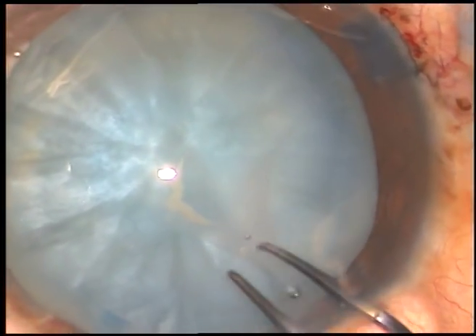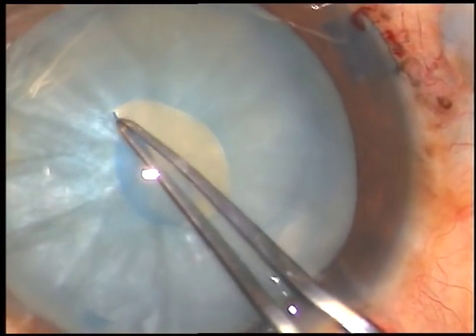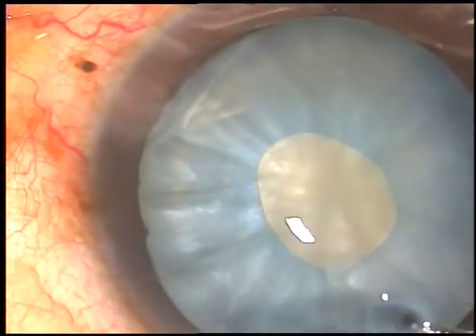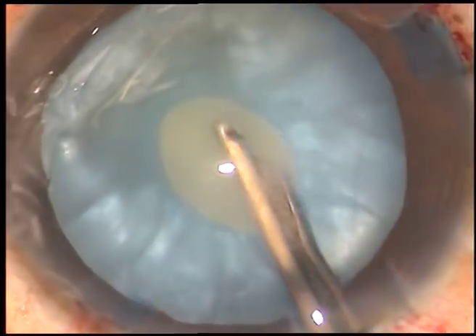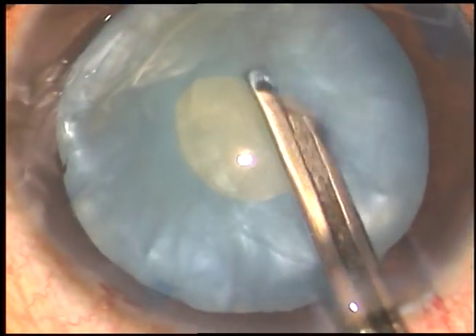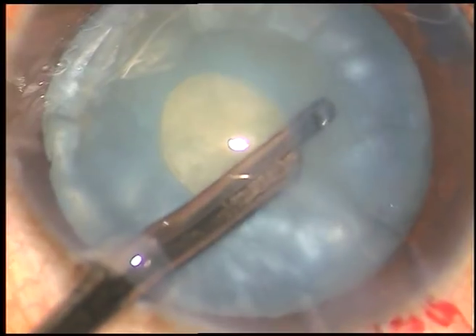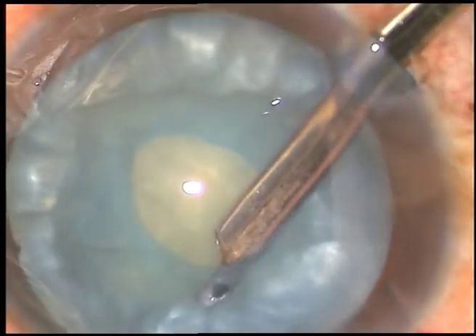Now the anterior capsule has been incised and see, some fluid came out. Now this is a small rhexis at this time. And now I am going to remove some cortical lens matter through this opening and reduce the intra-lenticular pressure.